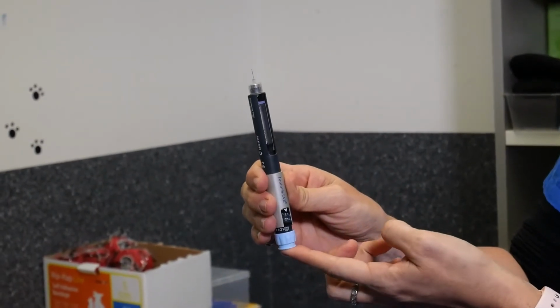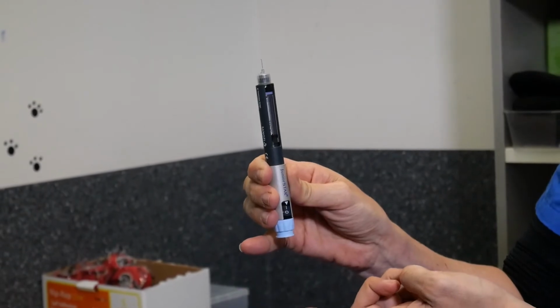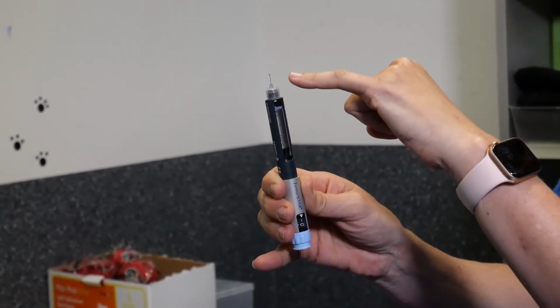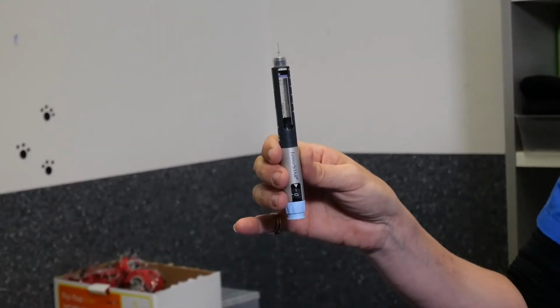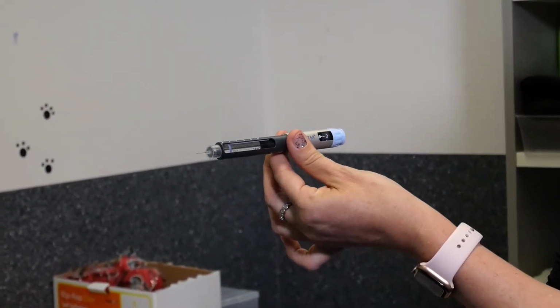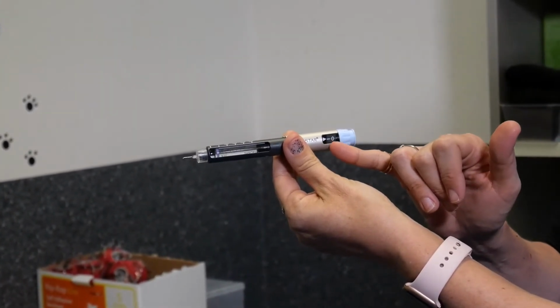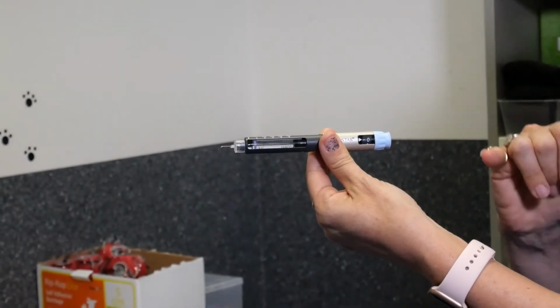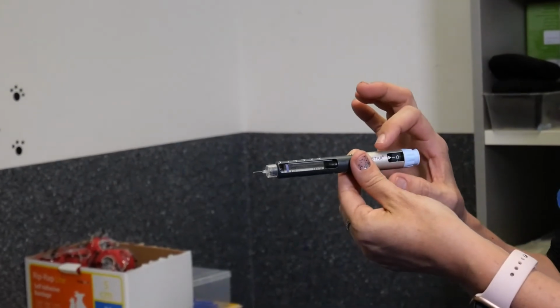If you look up here, you'll see all of that insulin come out. There's a little blob of insulin at the top here, so you just give that a shake to get rid of that insulin. If we look back at the dosage window again, you'll see that the window has now returned to 0. That means that the pen is primed and you're now ready to turn the dial to the correct dosage for your cat.